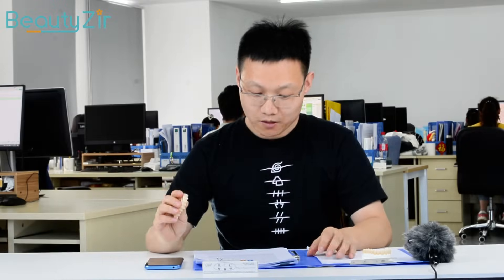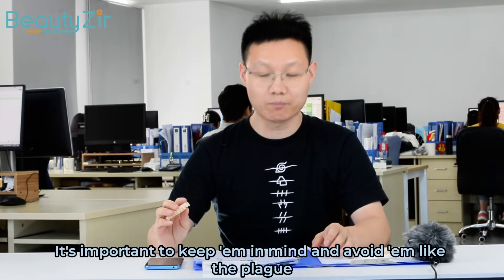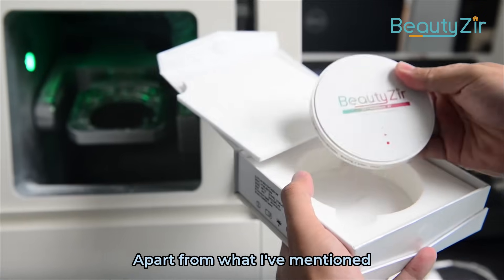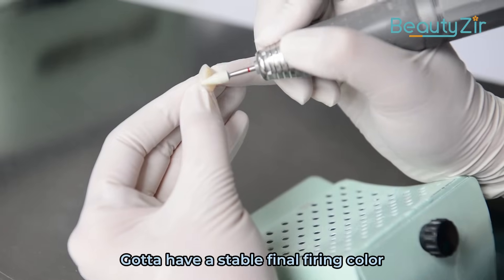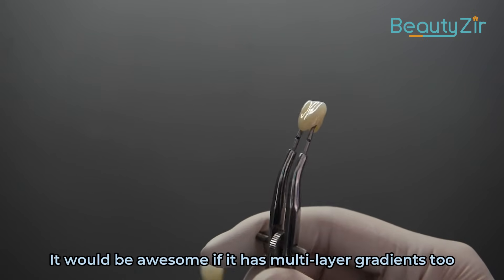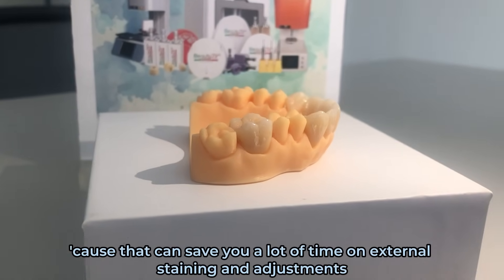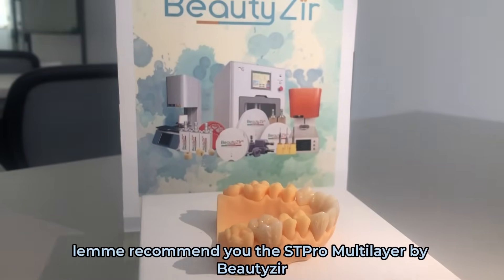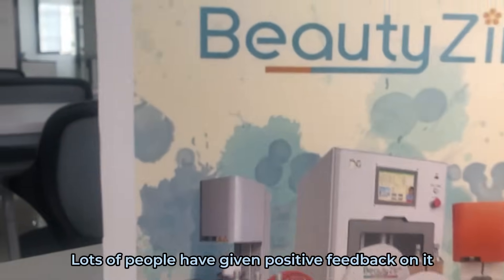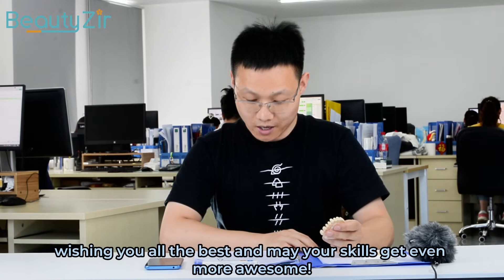Those mistakes mentioned earlier are pretty common in the manufacturing process of zirconia dentures. It's important to keep them in mind and avoid them. Apart from that, it's crucial to choose a high quality material with a stable final firing color. It would be awesome if it has a multi-layer gradient too, as that can save you a lot of time on external staining and adjustments. I'd recommend the ST Pro multi-layer zirconia — lots of people have given positive feedback on it.